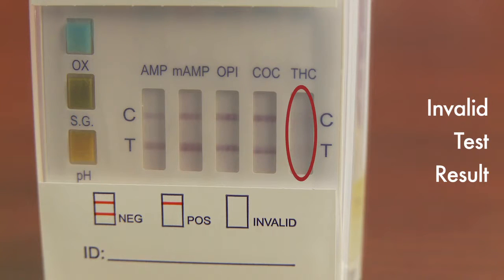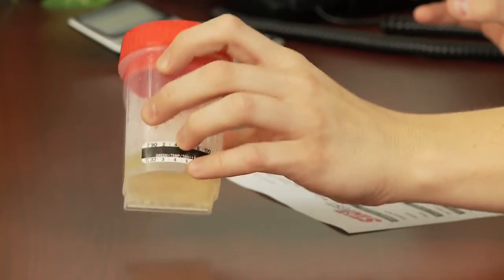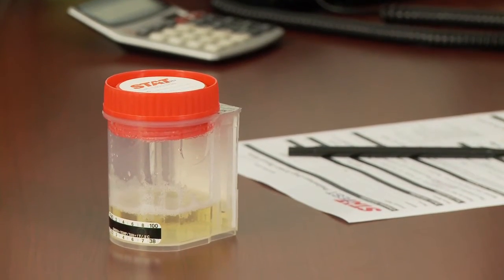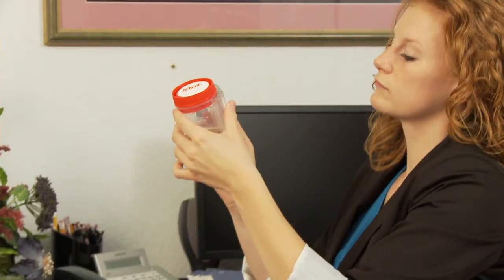If only one of the red control lines does not appear, try tilting the device toward the invalid strip and tapping the bottom of the StatCup lightly on the desk to aid the flow of the specimen and break up any air bubbles. If this does not help the line appear, the test is invalid. If this occurs, open a new package and pour the original specimen into a new StatCup.